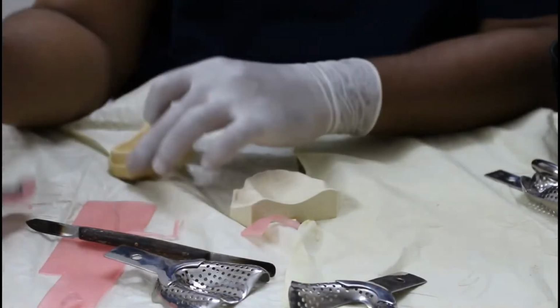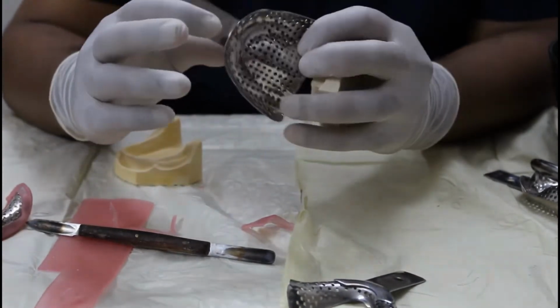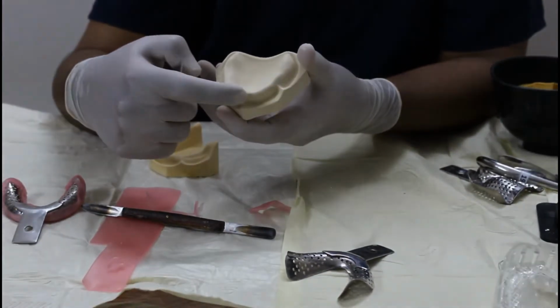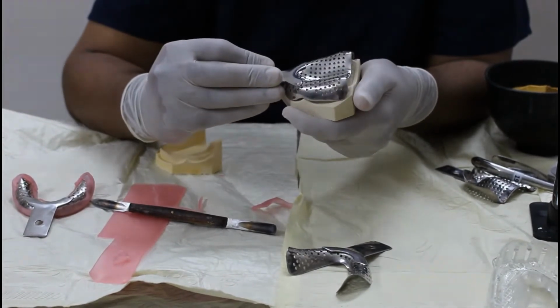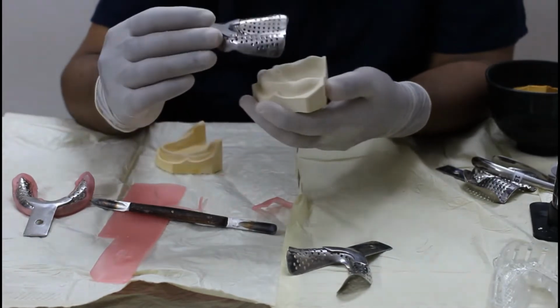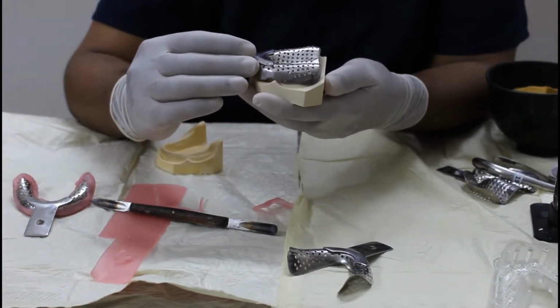Okay, now when you are loading the material, we have to make sure that the central part of the tray should coincide with this frenum area. So you have to put the tray in such a way that it coincides here. And always remember, when we are making an impression, we always load the tray posteriorly first and then press anteriorly.